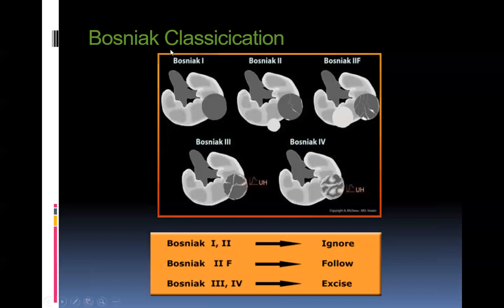So if you look at this cyst, obviously the size is also important. It should be around 3 or 3.5 centimeters in size. Anything less than that doesn't fit into the Bosniak classification. So a 3 centimeter cyst which is anechoic. Anechoic means jet black, because fluid is obviously black on CT. So this is a classification based on a contrast study, that is a CT scan. You can also use MR to evaluate this cyst, but obviously the more frequently or easily available one is CT scan. So with CT scan, the cyst is anechoic and doesn't show any enhancement of either the wall or any septa inside.